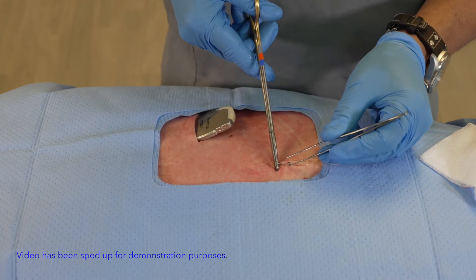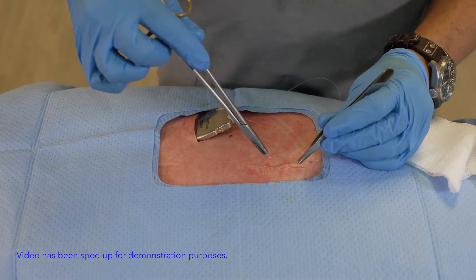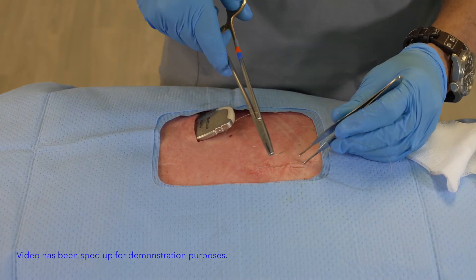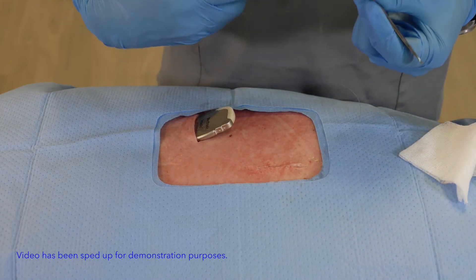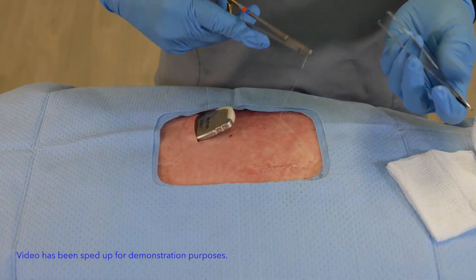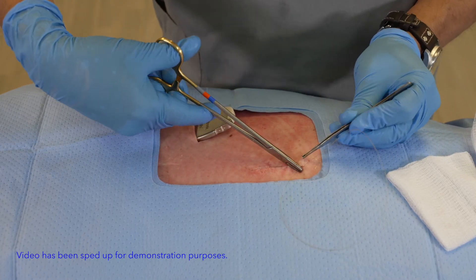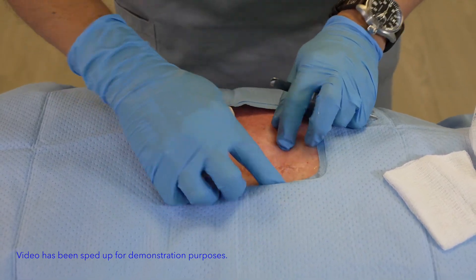As we finalize this superficial layer you'll see the technique of finishing the closure is exactly the same as the level below — we once again pass through the skin and cut the suture, eliminating the need to tie knots. Many of my peers find this to be their greatest struggle: getting comfortable with the security without tying knots. In this case it's not of concern at all. I simply pass through the skin, cut, and what we have here is a very nice and secure wound that I can't peel apart even with pressure.